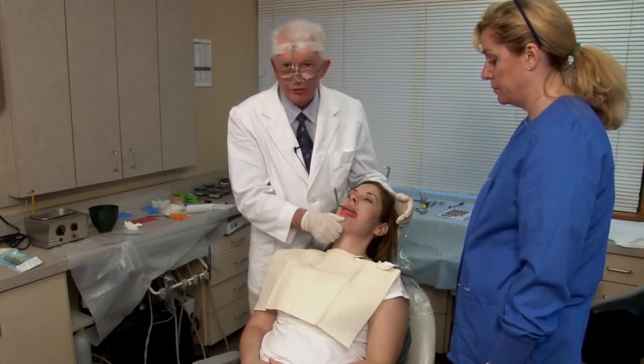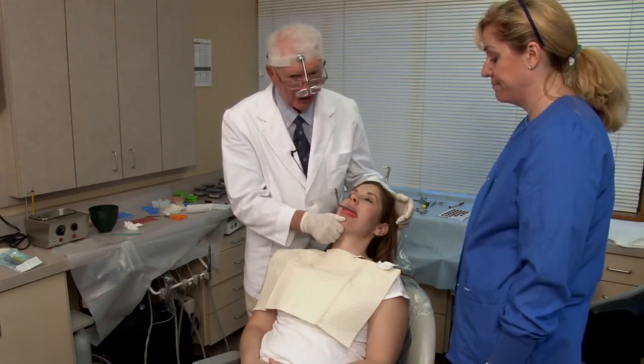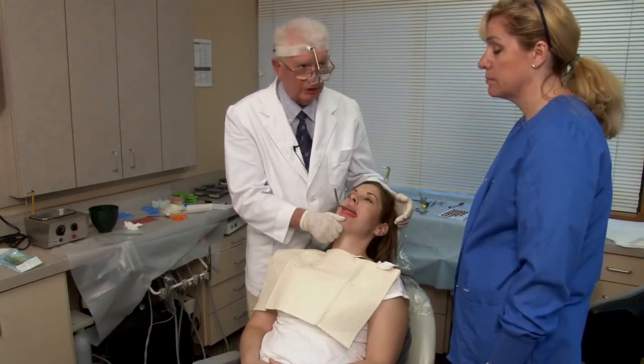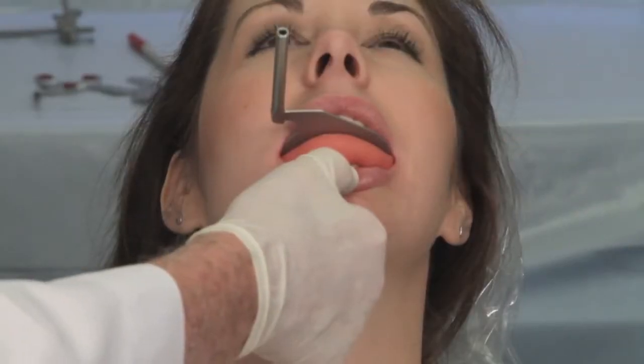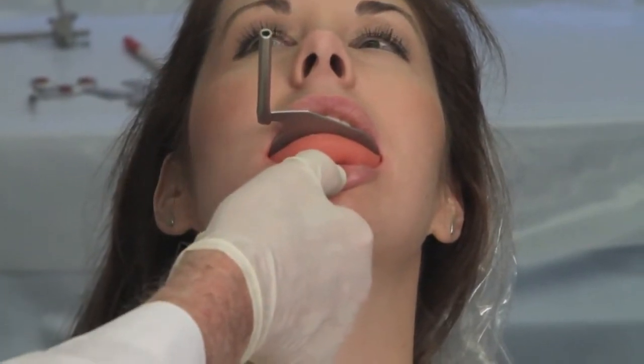Notice that I said that 3 or 4 times in different ways. I want to make sure the patient understands that we've got to keep this against the upper teeth with no movement whatsoever. Now stay closed on that, hold it against your upper teeth. Do not let it come off of your upper teeth.